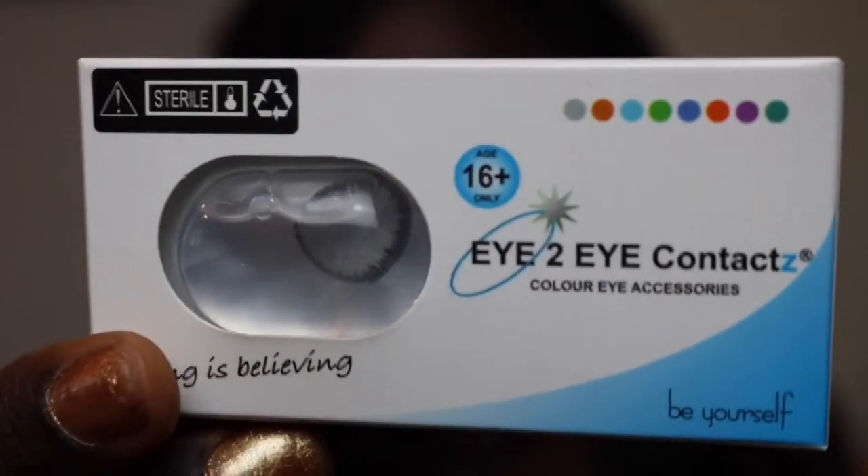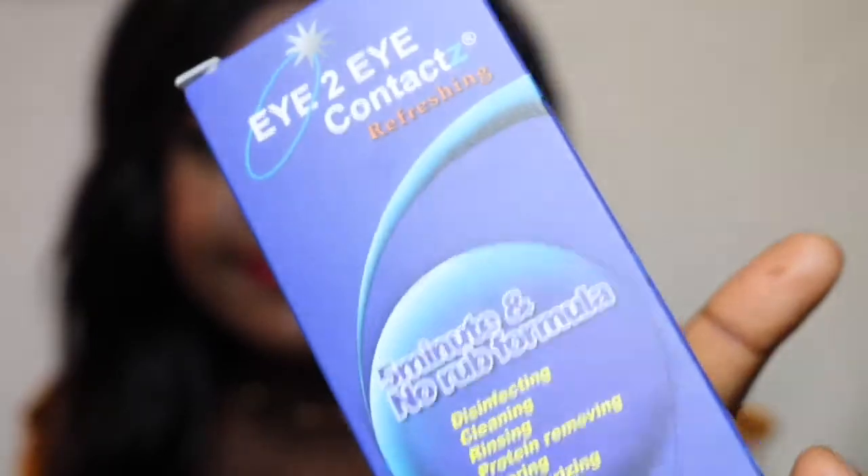It came in this pack — obviously that's the contact lenses and that's the solution in which you store the contact lenses. I literally just picked up the gray ones today. That's what it looks like — that's a gray color contact. You have your contact lens container, your contact lenses, and your solution.